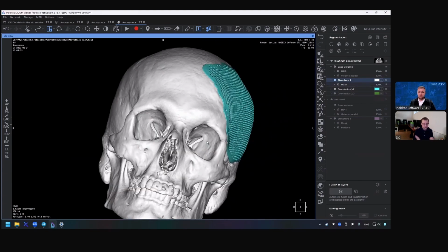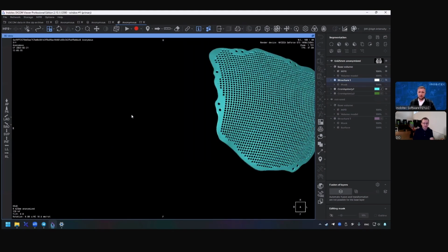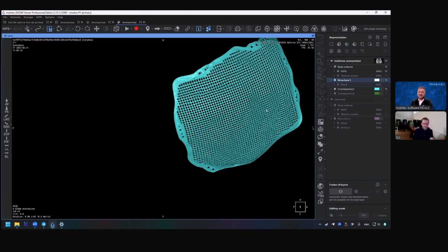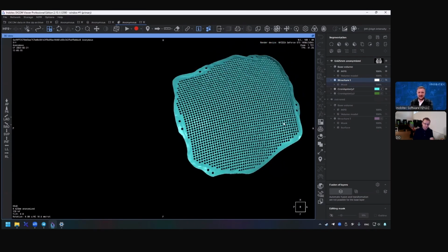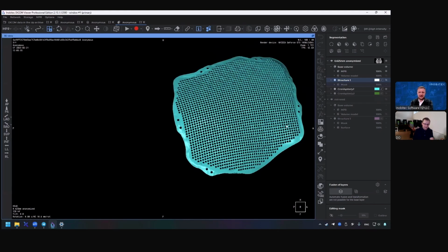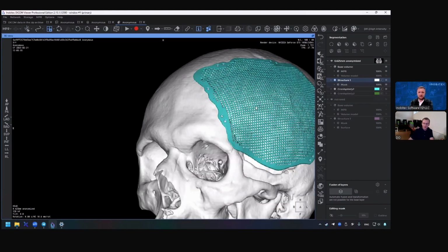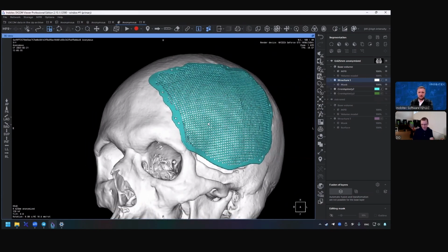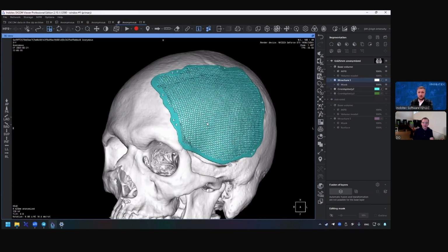Absolutely great software. And thank you, Igor. Thank you to your team for development of such an excellent program. I'll try to do my best to investigate all these instruments, all new instruments, and I look forward to seeing new features in your program. Thank you a lot.